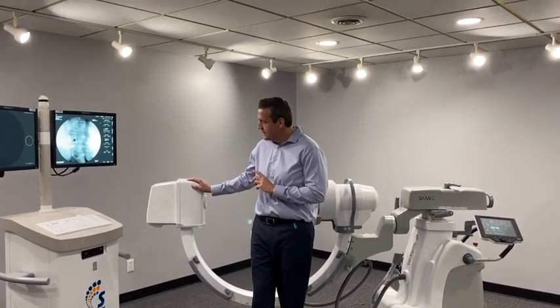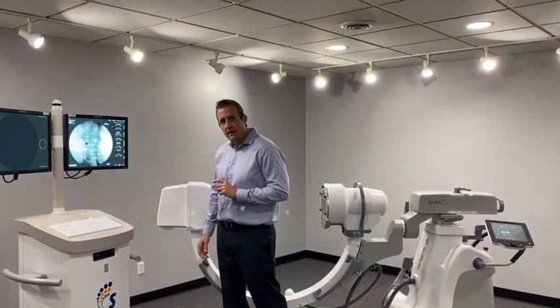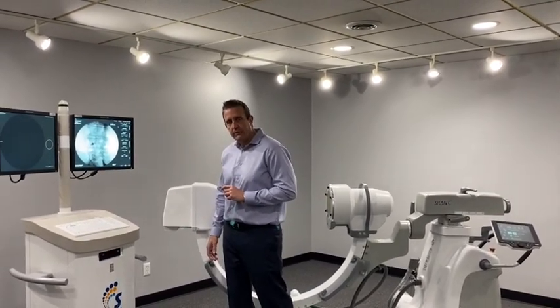This is a high heat capacity, high frequency generator. I can literally stand on the foot pedal for 10 minutes before the system would need to cool down. They achieve that through their patented vacuum technology.